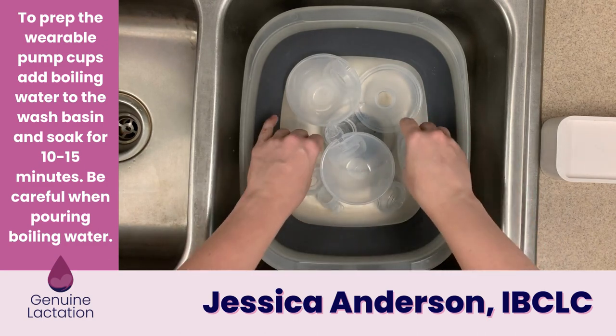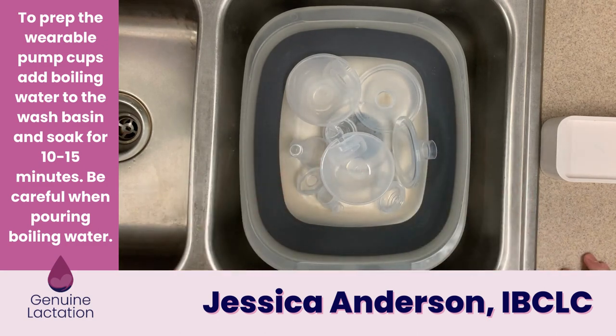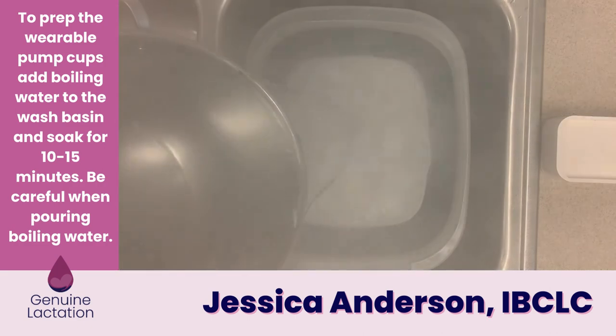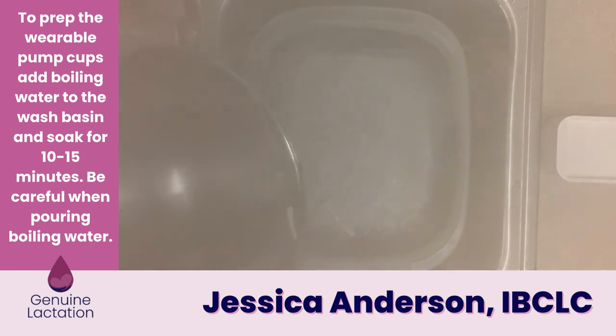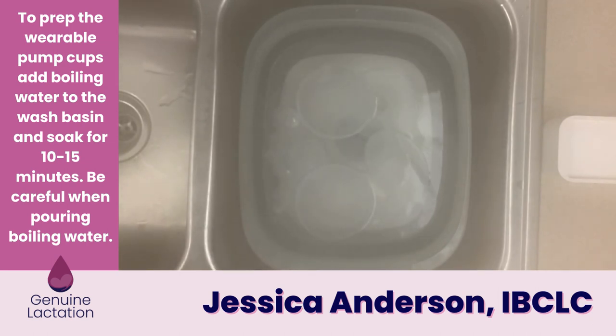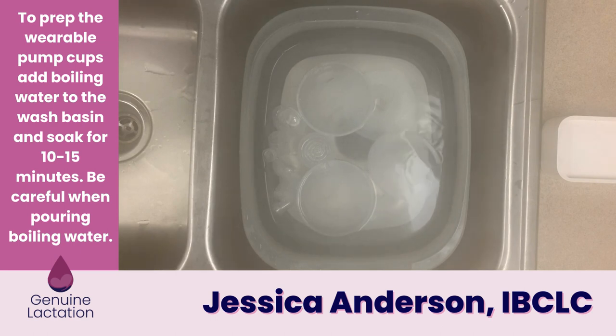The reason I recommend this versus boiling them in a pot on the stove is that when you boil things in a pot, you risk the cups coming into contact with the sides and bottom of the pot, which are hotter than the boiling water itself. Using this method, the water is at boiling temperature — so it will sanitize the parts — but it won't be hot enough to damage them.